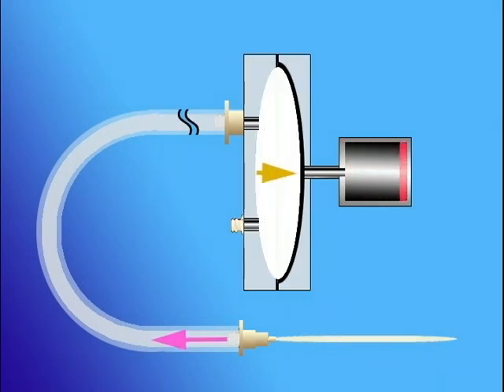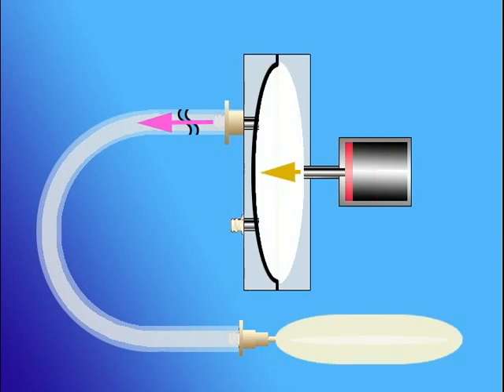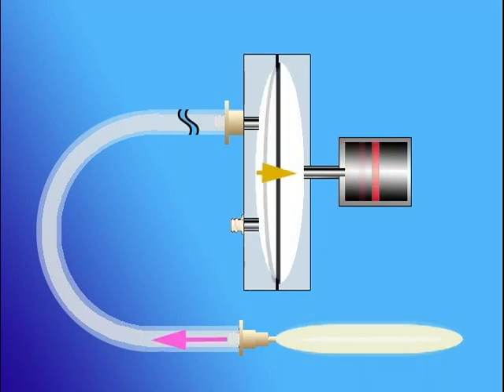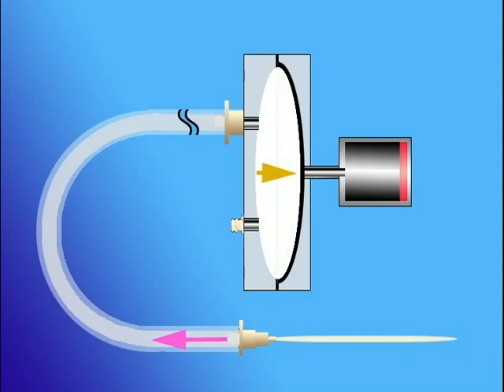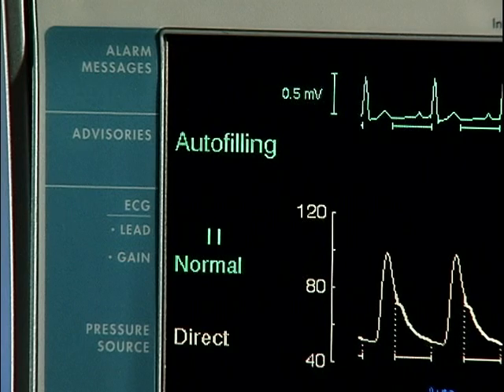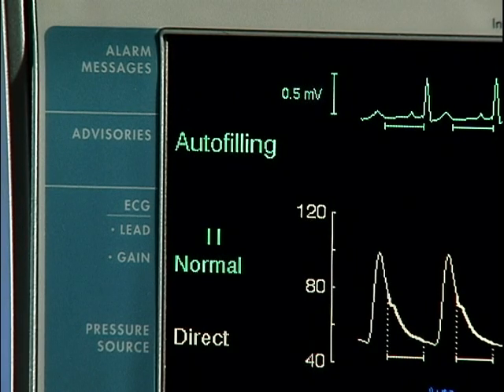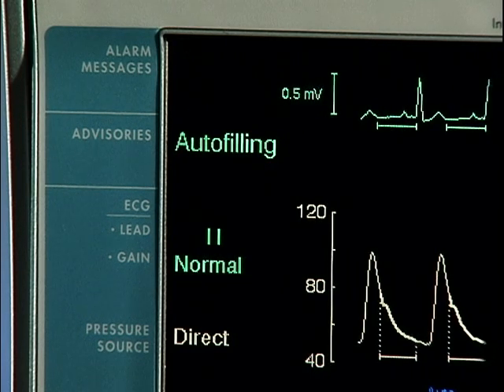At the onset of diastole, pressure is applied, causing inflation of the balloon. Vacuum is applied just prior to the next systole, causing deflation of the balloon. Every 2 hours, the autofill will purge and refill the patient's safety disc system. During this time, pumping will stop and the autofilling message will be displayed.